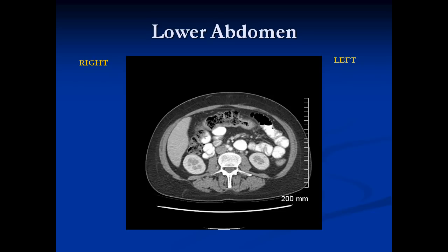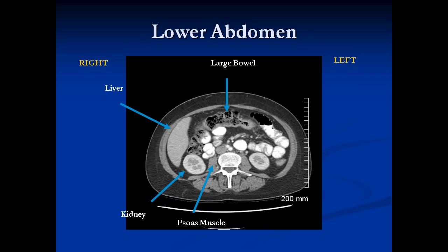Going a little further down into the abdomen, we're at the lower edge of the kidneys. We see just the tip of the liver and a little of the spleen. These structures are the lower poles of the kidneys. We see the psoas muscle on each side next to the spine — a very important structure. All these structures are outlined by black fat, which sits in the retroperitoneum and in the mesentery, allowing us to see them much more clearly. This piece of bowel with black and gray material is the transverse colon containing fecal material. Here we have the aortic bifurcation into the common iliac arteries, and right next to it the inferior vena cava.